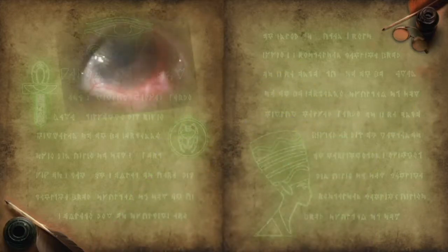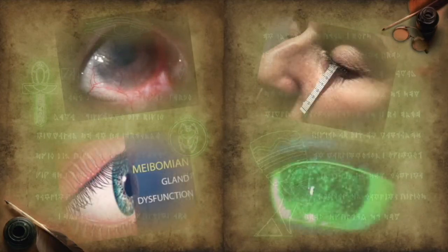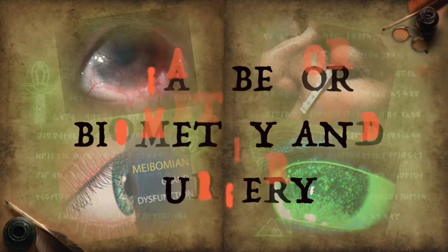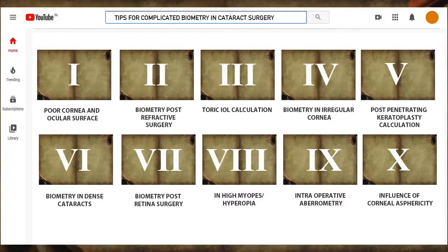Ocular surface disorders, MGD, dry eyes, and punctate keratitis need adequate prior treatment before biometry and surgery. The next scenario is biometry post-refractive surgery.